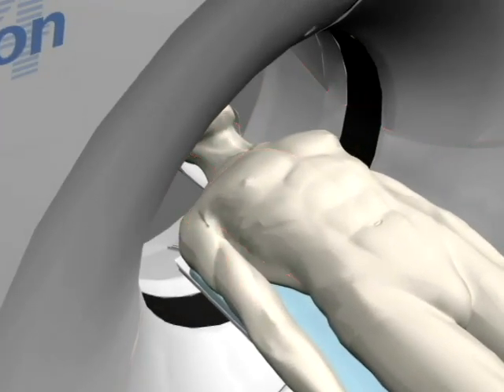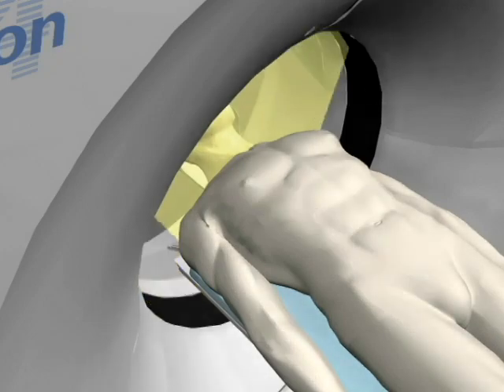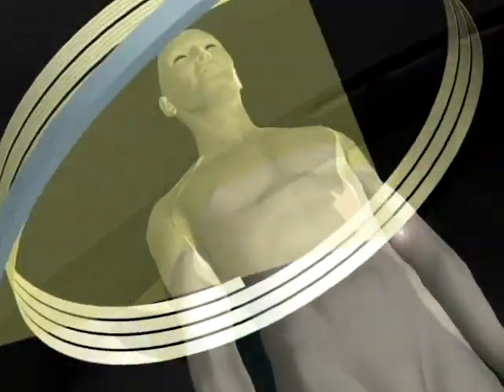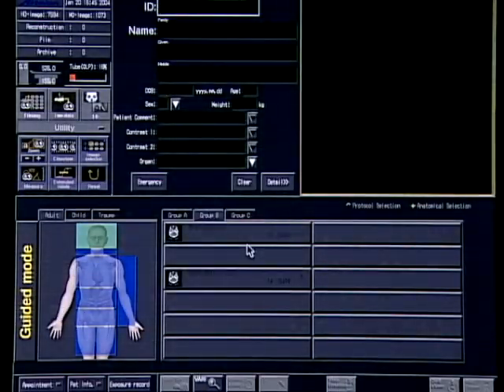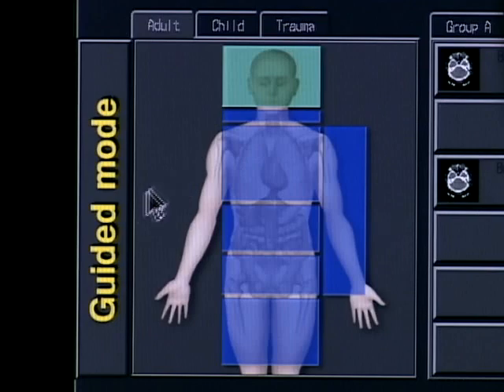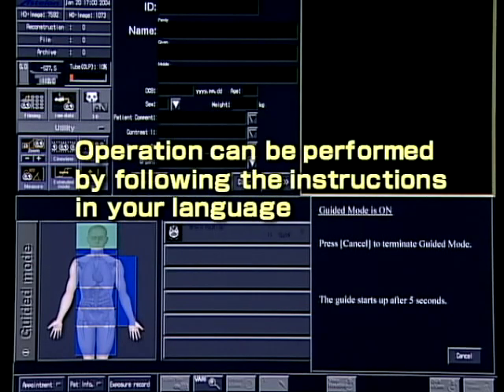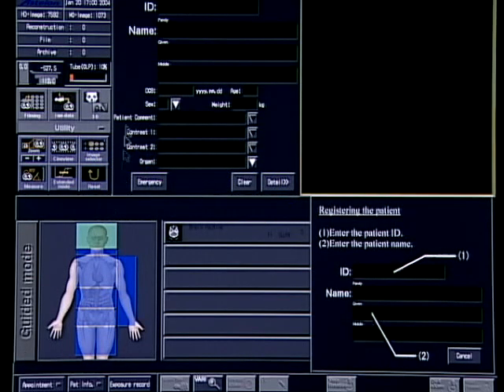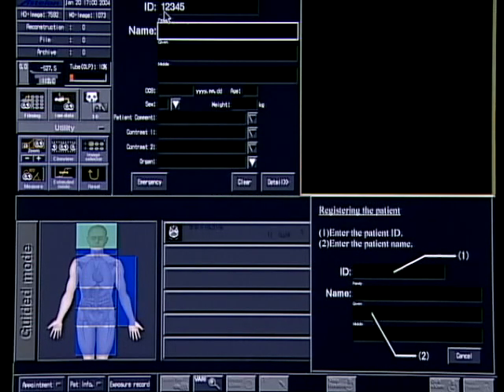Let us now do an actual examination with Astian Super 4. First, select guide mode, then register the patient. Each subsequent operation is indicated in the guide window at the bottom right corner of the screen. Let us operate the system following this guide.